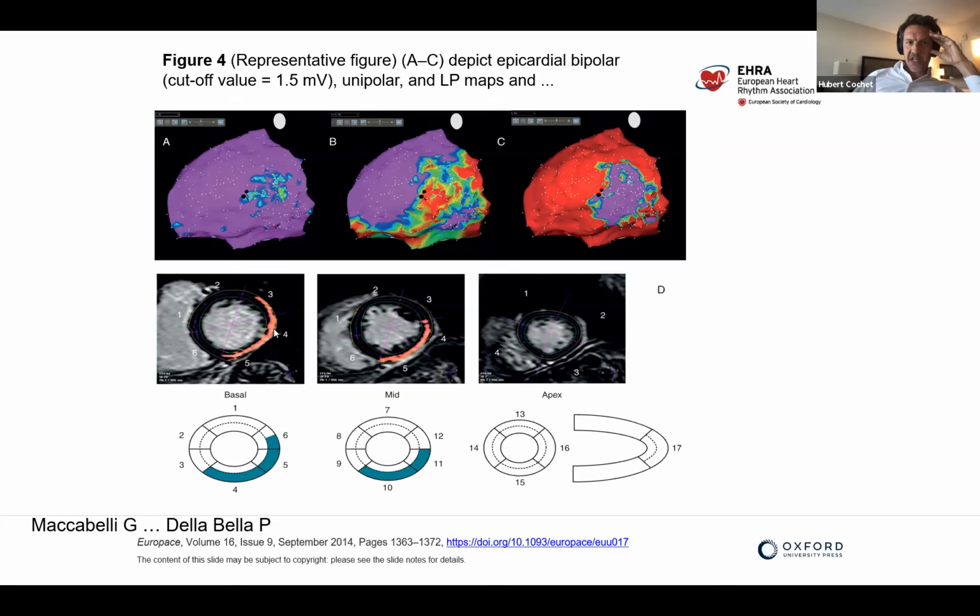So in the left image, it's on the inferior and septal side, and in the right image, it's on the lateral side. And each time you have an epicardial substrate, it's on the borders that it will go deep inside the mid-myocardial layers. So you should expect that. It's almost always the case. Yeah, and the little fingers seem to just go on like in the myocardium. Exactly. And sometimes it goes up in the septum, and then it gets covered by the right ventricular fibers of the septum. So a subepicardial scar will get intramural on the septum very often.